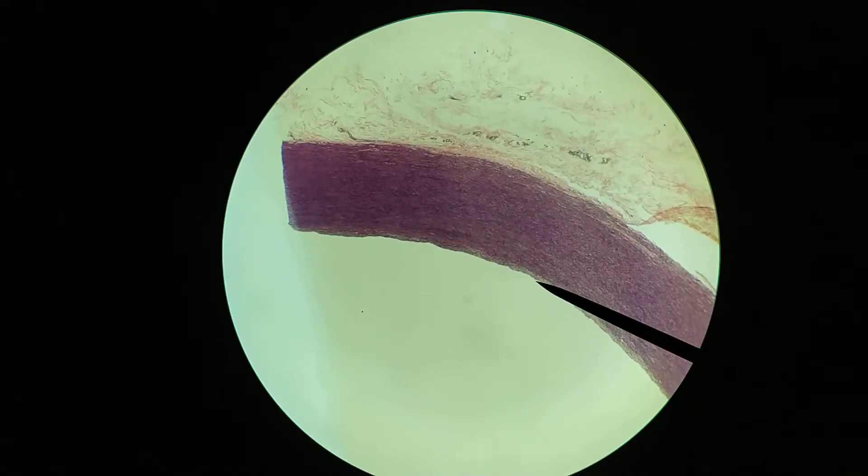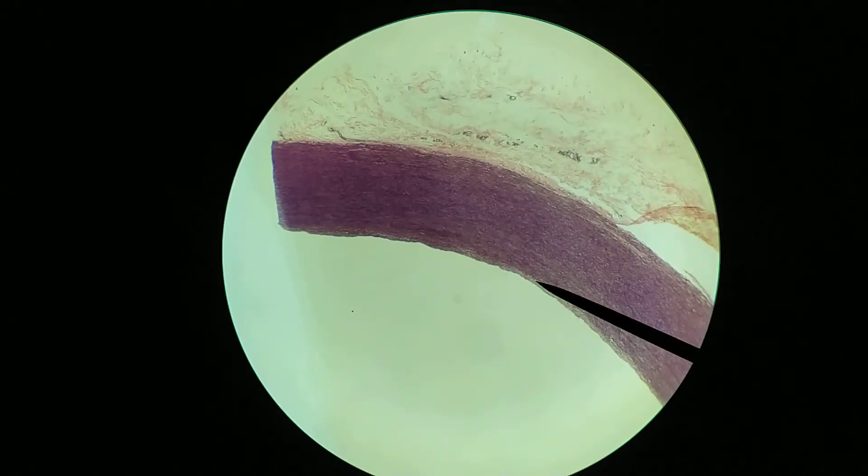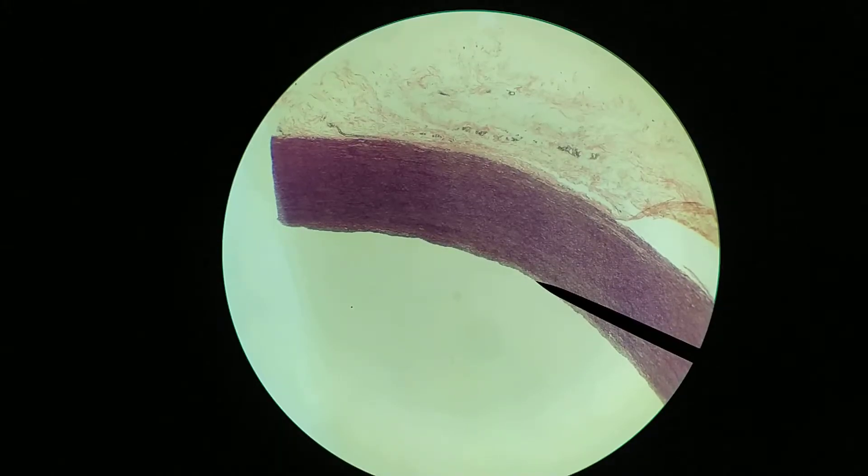So this first layer, the tunica intima, is this region right there. It's kind of a more lightly staining region.